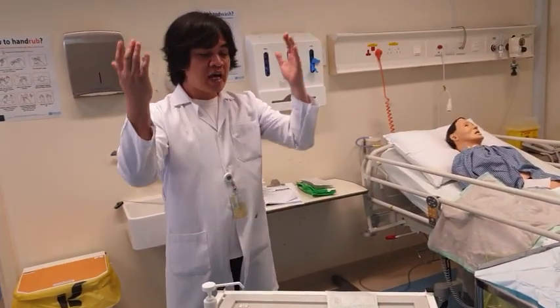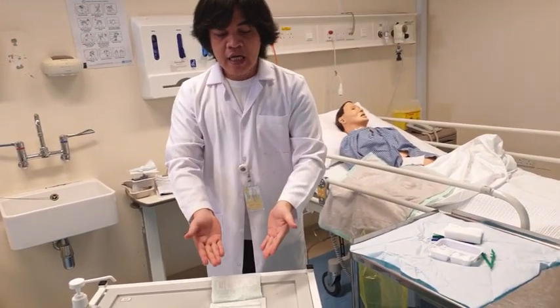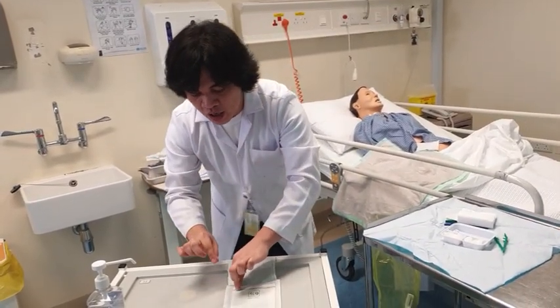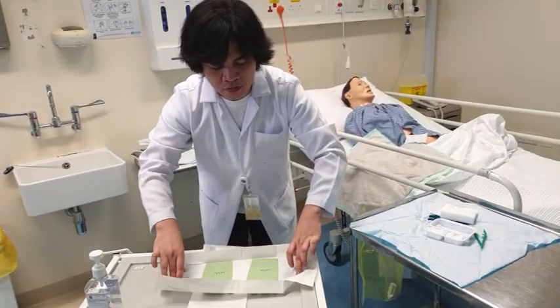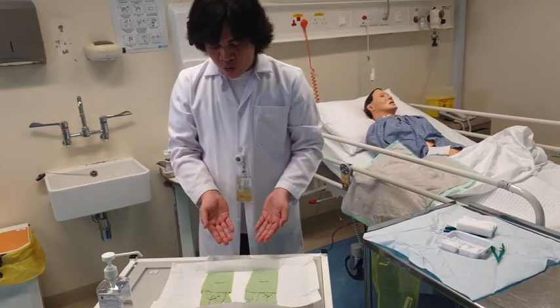So assuming that I'm done with my surgical hand washing, I'll go back to my patient. Okay? And start performing surgical gloving. Without touching the table, open the package. And you will see there would be two.